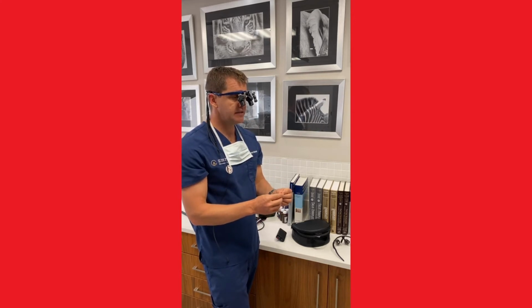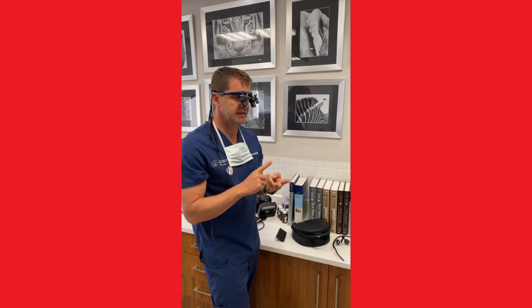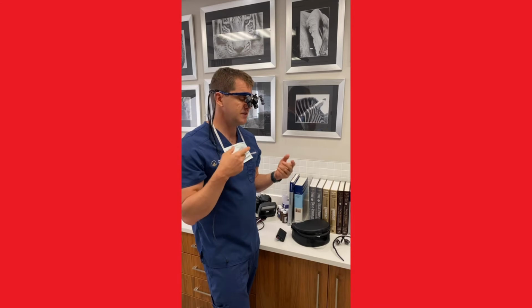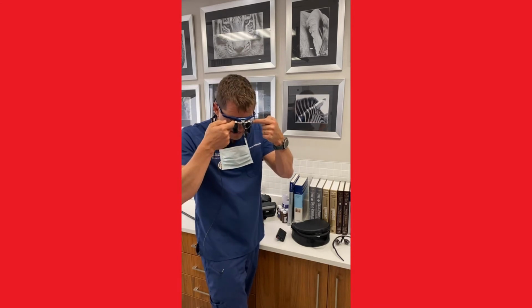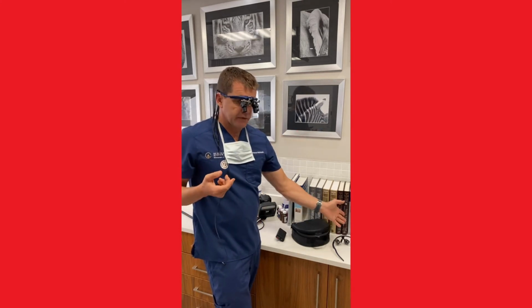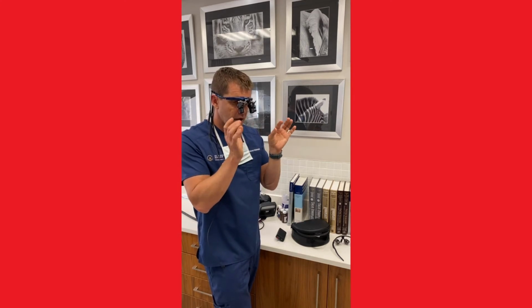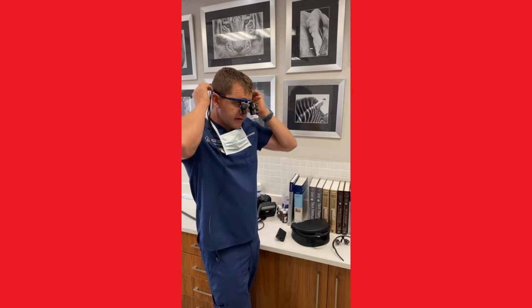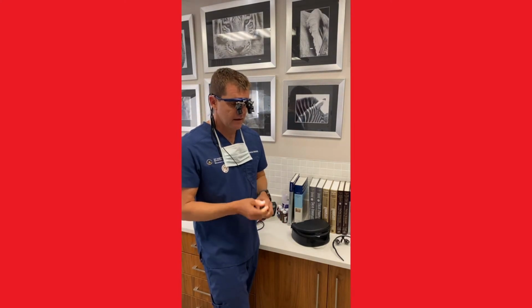The other thing which is very interesting is this very wide field of view, okay? So those are the two things that stick out for me. You can obviously choose a 3.5, a 2.5, whatever. I've got 2.5s here. They are also adjustable for interpupillary distance. So unlike, for example, the Surgitel guys where they had to test my eyes and then fix them, this is adjustable, okay?